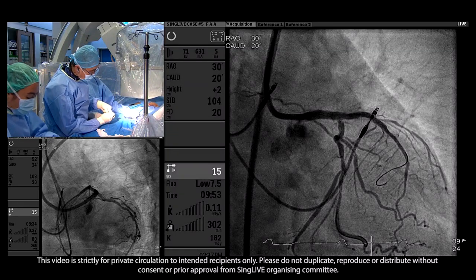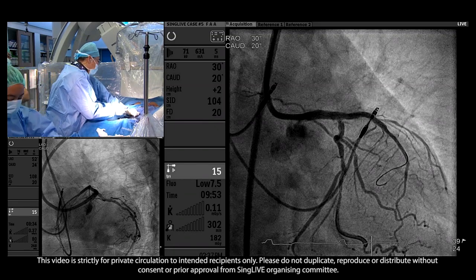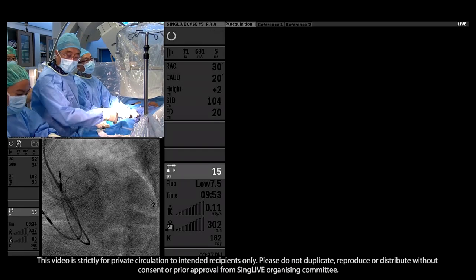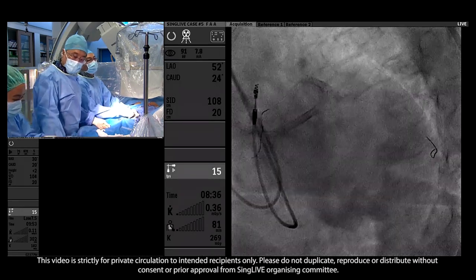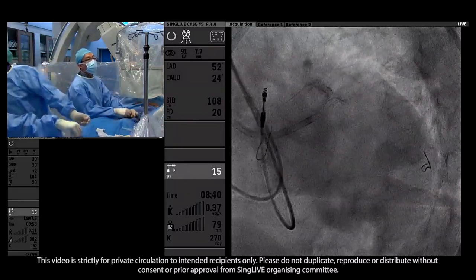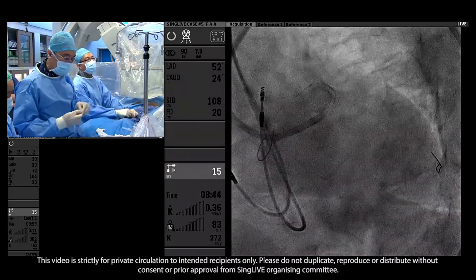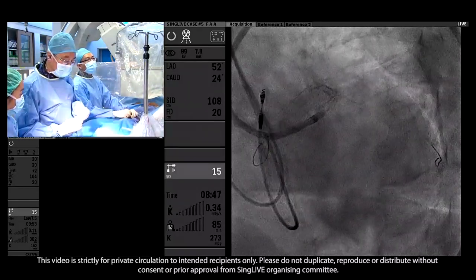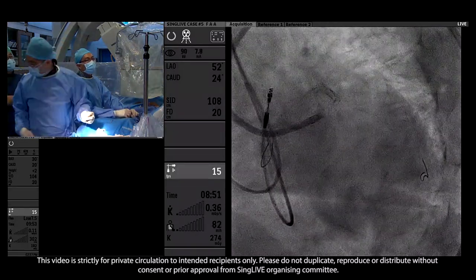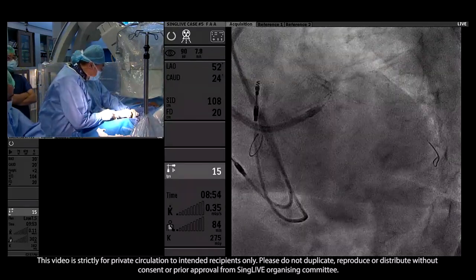Even so, if you want to put in the Onyx in the distal bifurcation complex region, you just keep the 1-month DAPT? I think it's pretty clear now that for all of the latest generation stents, whether with a PVDF polymer or a biodegradable polymer, re-endothelialization is predominantly complete by 1 month. If there's a suspicion that somebody is going to have delayed re-endothelialization, then maybe prolong it, but I think 1 month is fine now.